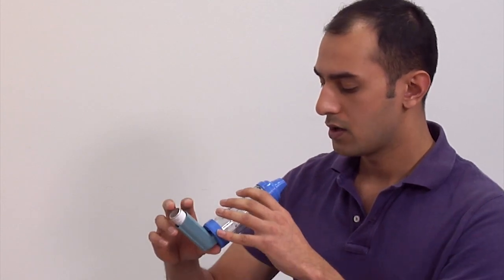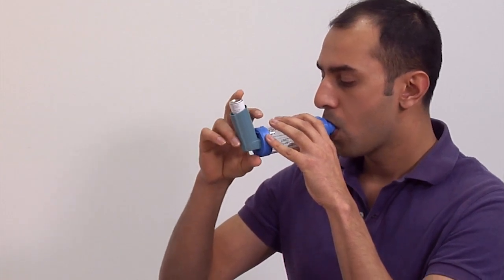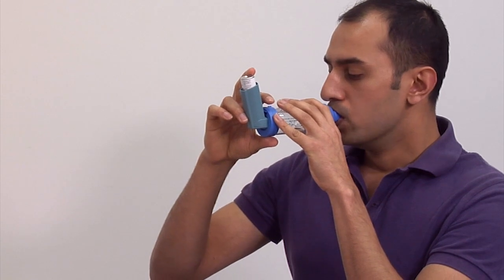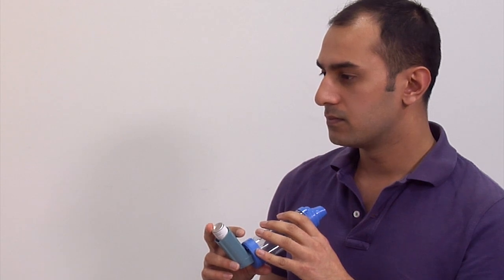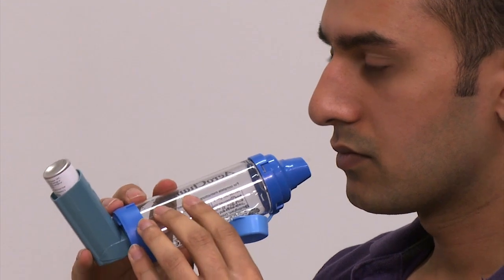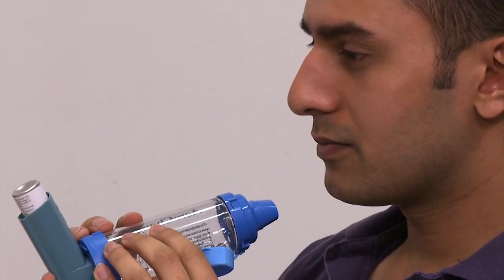Can you try that now for me? And then hold that for ten seconds. Okay, very good. So the good thing about this device is that it'll make a whistling sound if you're breathing in too quickly. If you don't want to take just one long breath, instead you can take two to three normal breaths if you prefer.